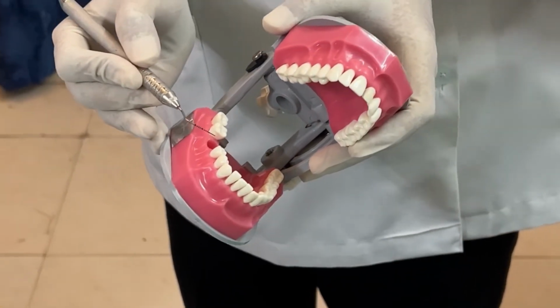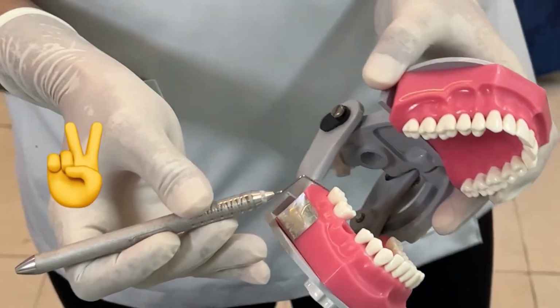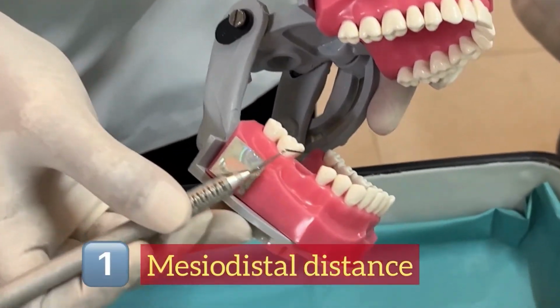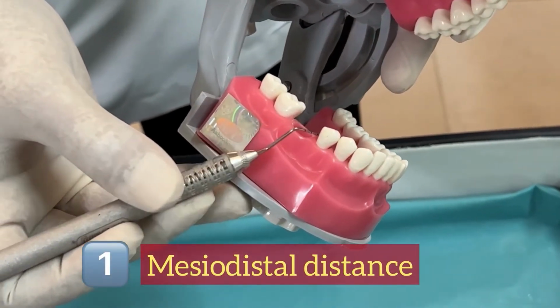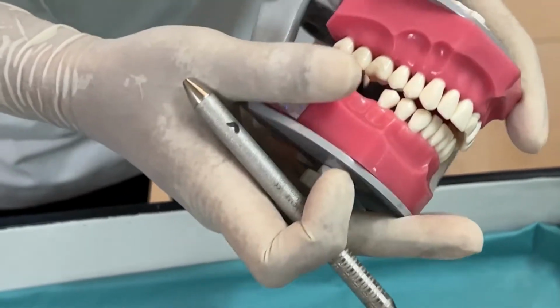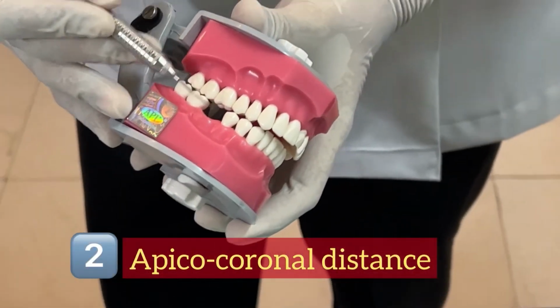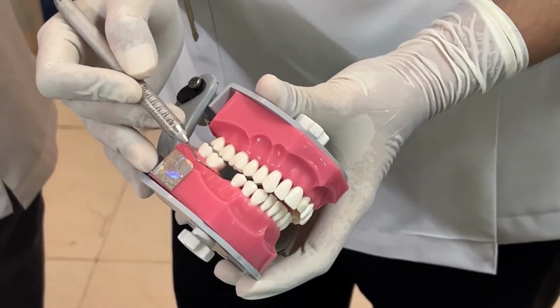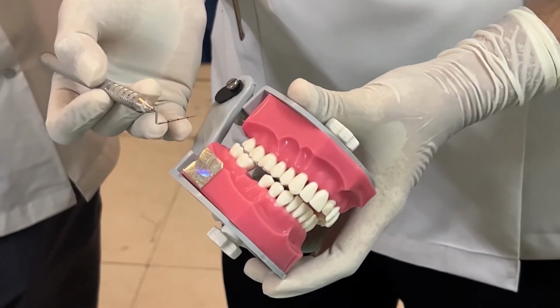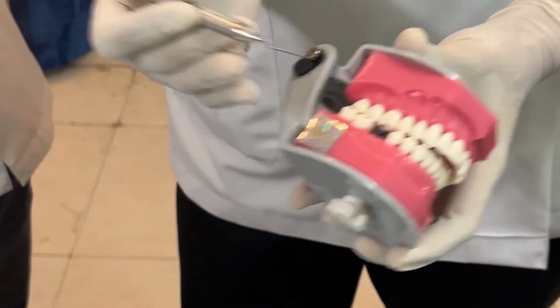The patient hasn't come for an implant, the patient has come for tooth replacement. So two things you have to evaluate. In 2 dimensions you are supposed to see whether ample mesiodistal distance is there for placement of a tooth, and then you are supposed to ask the patient to occlude, and see whether in the apicocoronal direction ample distance is there for placement of a tooth. So this is the prosthetic treatment planning with regard to a single tooth replacement by an implant.